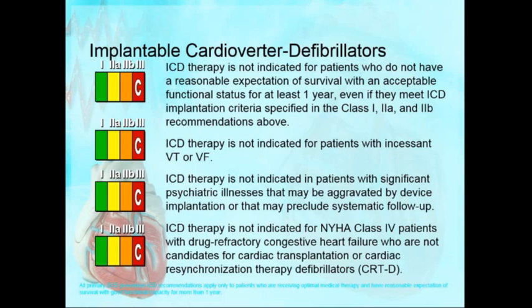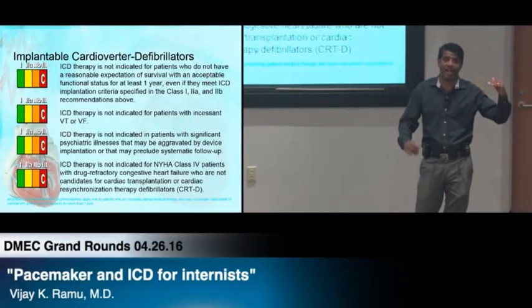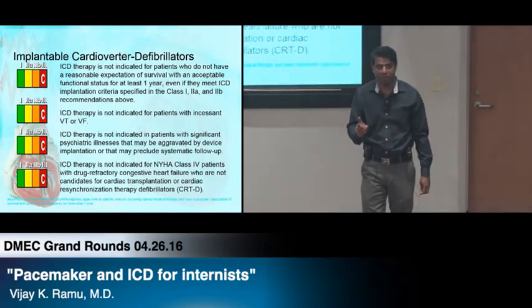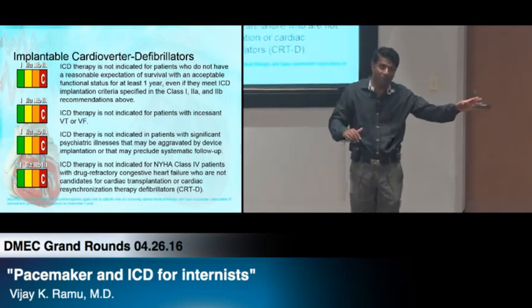You are protected by the books, so it's not like you did something completely wrong. His INR is 2.5, put a pacemaker in at 2.5, you're not wrong, because literature has shown there is not a statistically big difference between therapies. However, if you do it on a patient with Lovenox or heparin, there's a higher incidence. Go figure that one. Coumadin is probably okay.